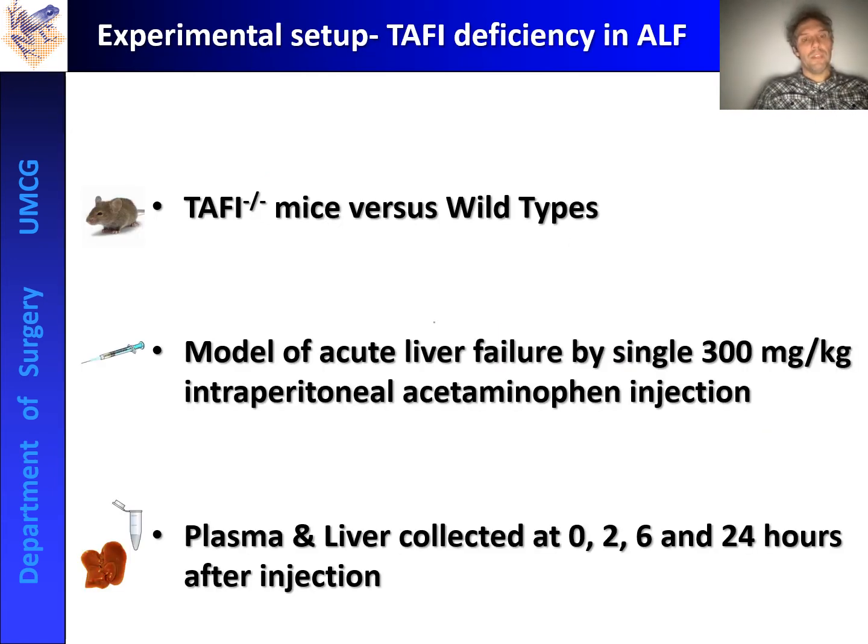So we were then eager to find out if we could reproduce these results in the context of acute liver failure. So again, we compared our TAFI knockout mice with wild-type animals, and we used a model of acute liver failure where we injected them with acetaminophen, which is paracetamol basically, in their belly. And again, we collected plasma and livers at different time points after injection to follow the course of liver failure progression.